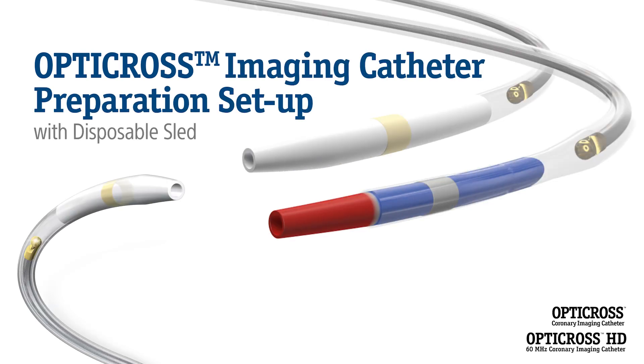Welcome to the Opti-Cross preparation setup. In this video we will walk you through the techniques and steps to prepare the disposable sled, MDU, sterile bag, and catheter for use as per the instructions for use.